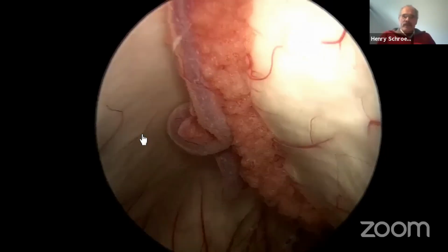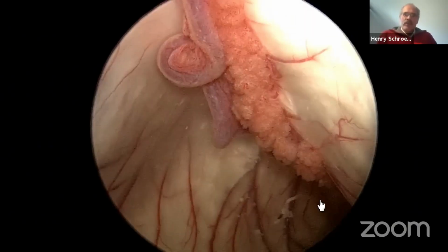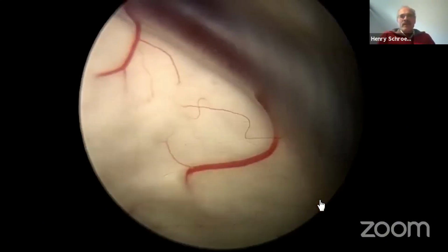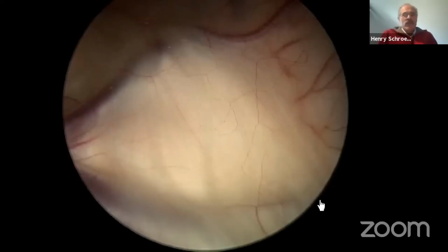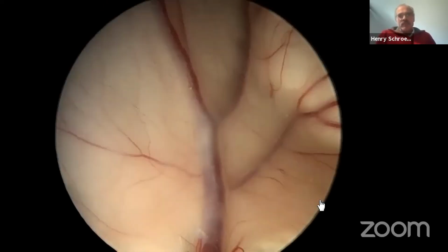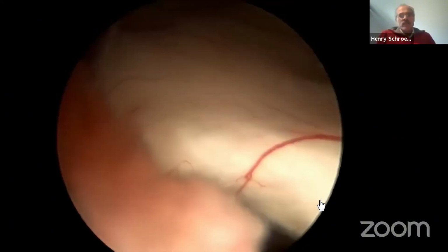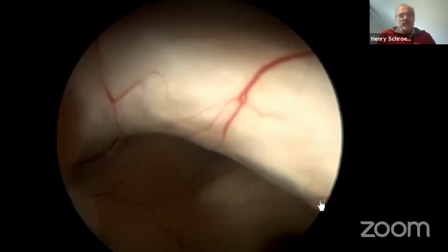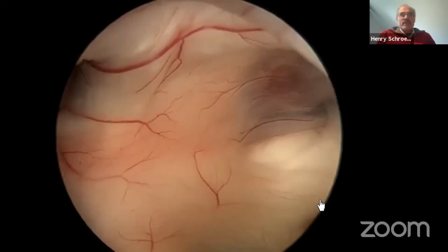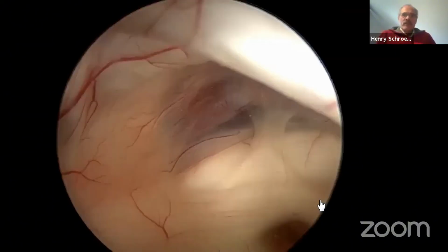And then we can, of course, not reach this area here because a flexible endoscope is required. In Germany, we have the problem that it's not allowed for us to have chip-on-the-tip flexible scopes in the brain because you cannot autoclave them, and the hygiene standards in Germany require that we have sterilization, autoclavable endoscopes when we are going to the brain. That's a pity for us, so we have to use old fiber scopes or rigid scopes.